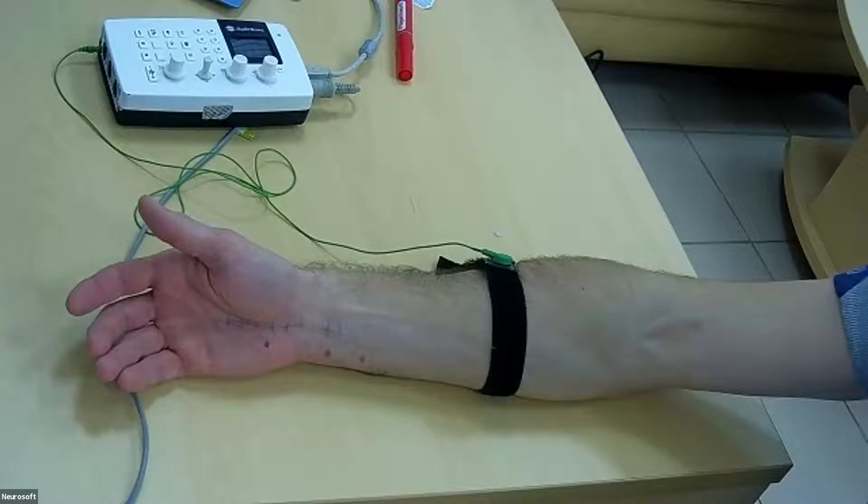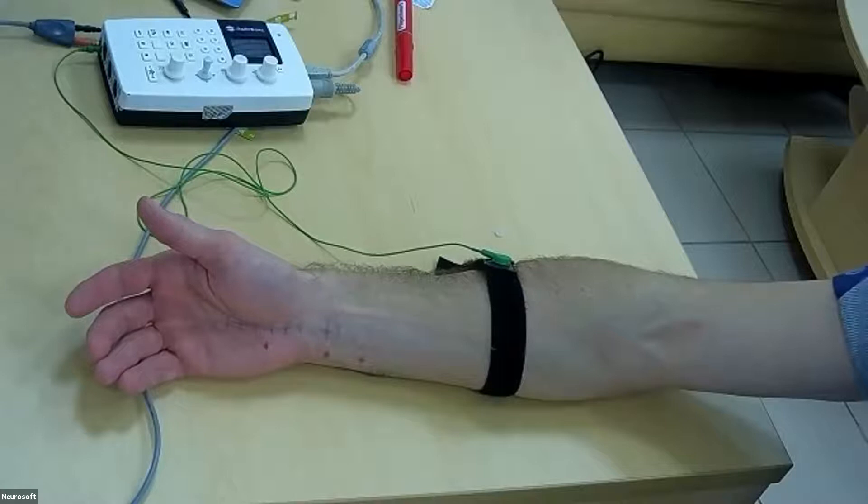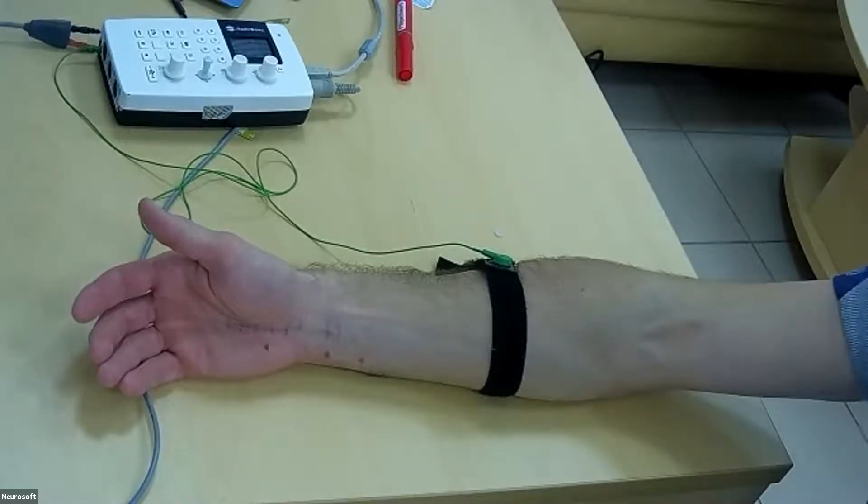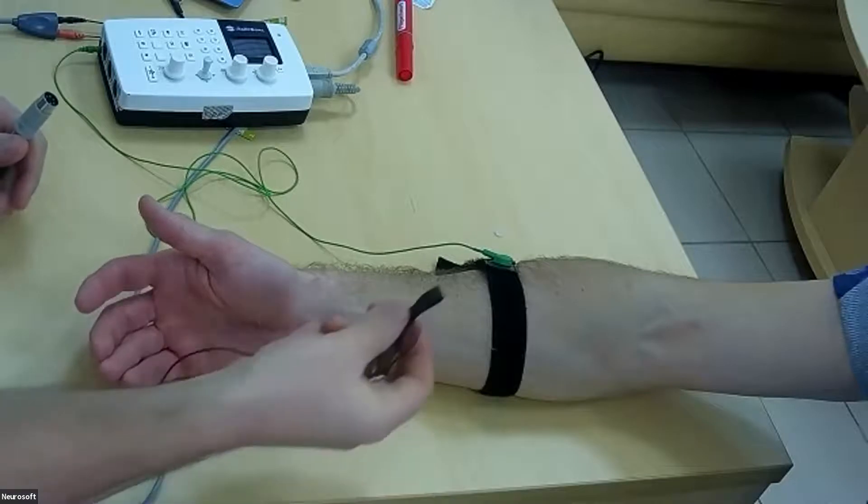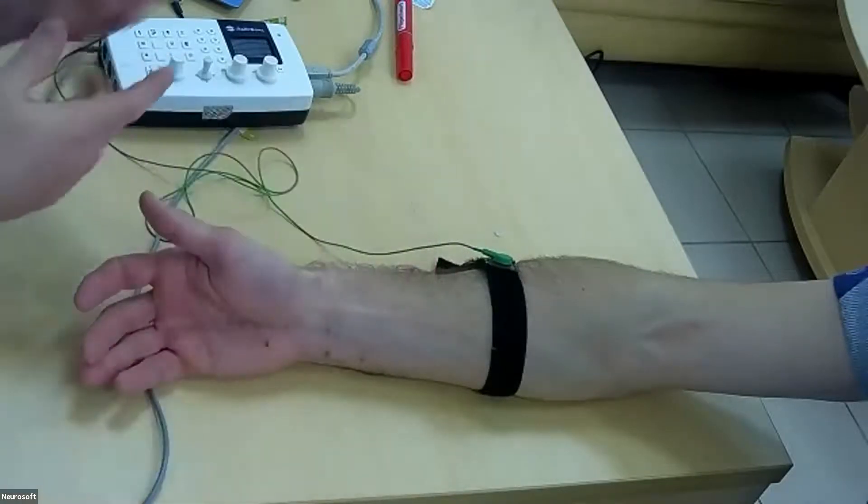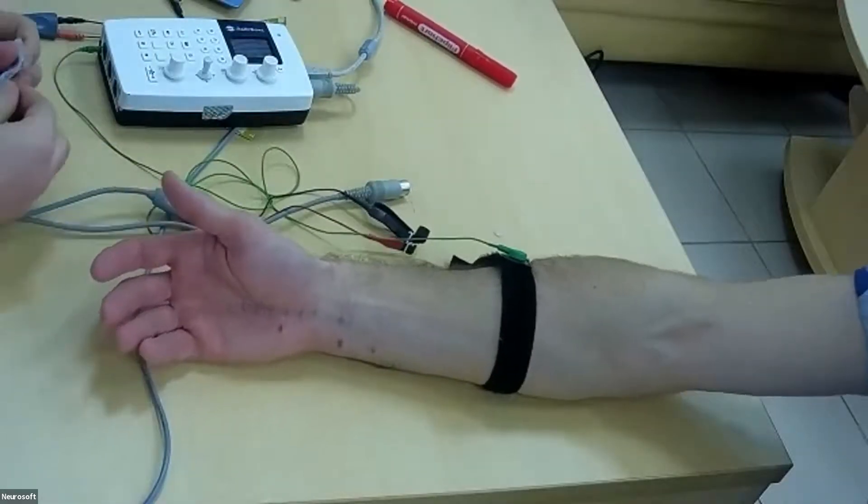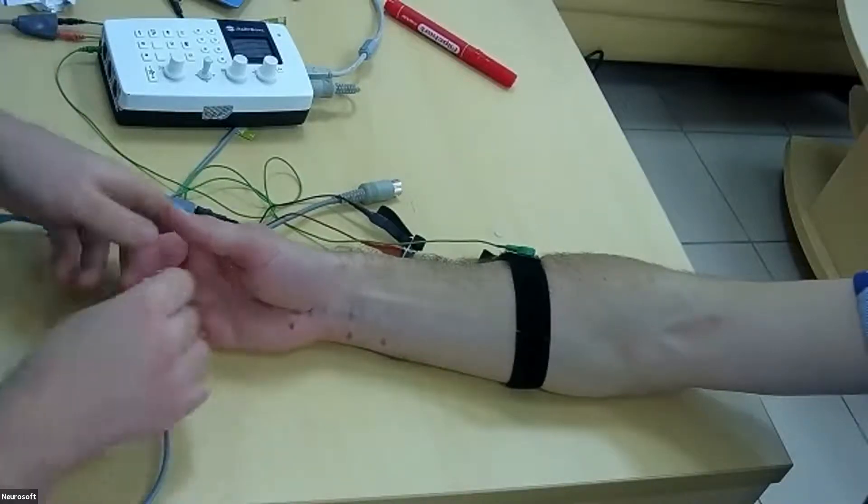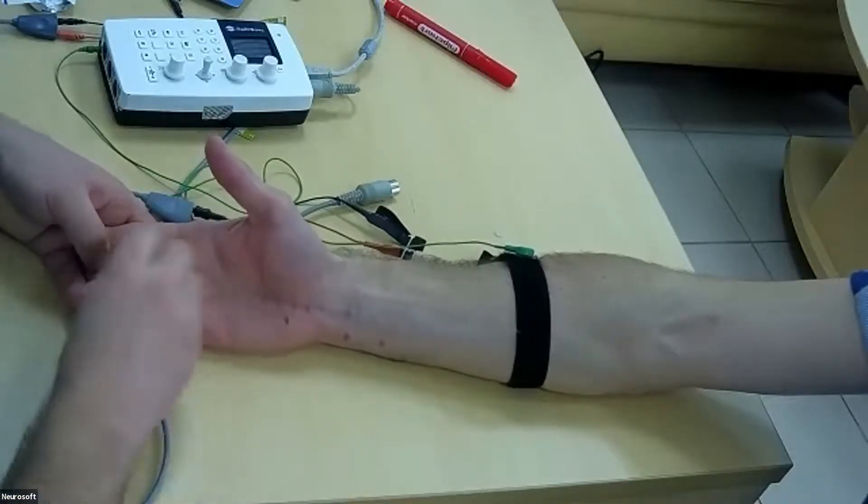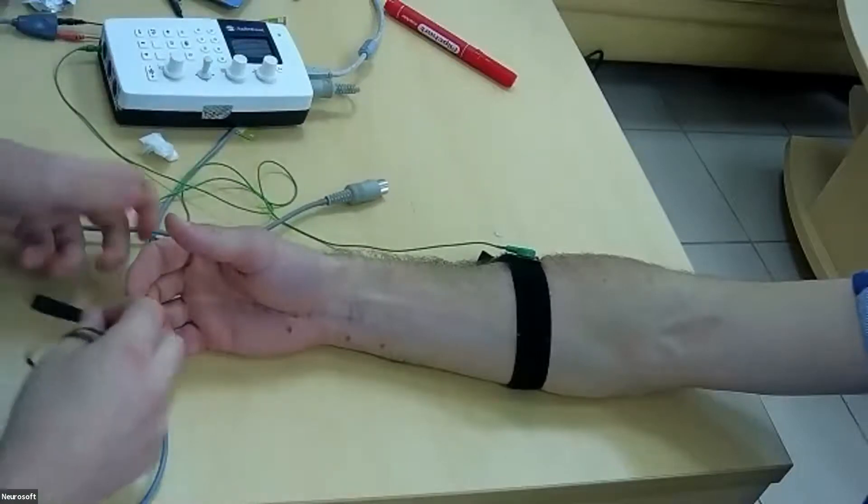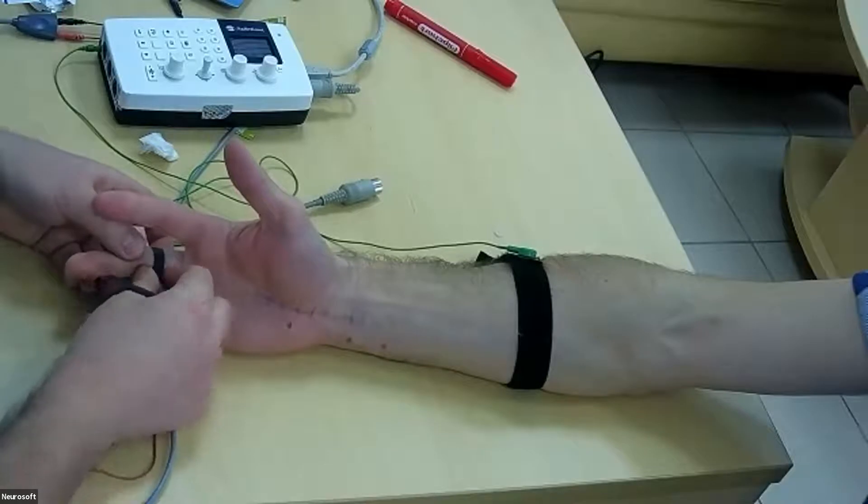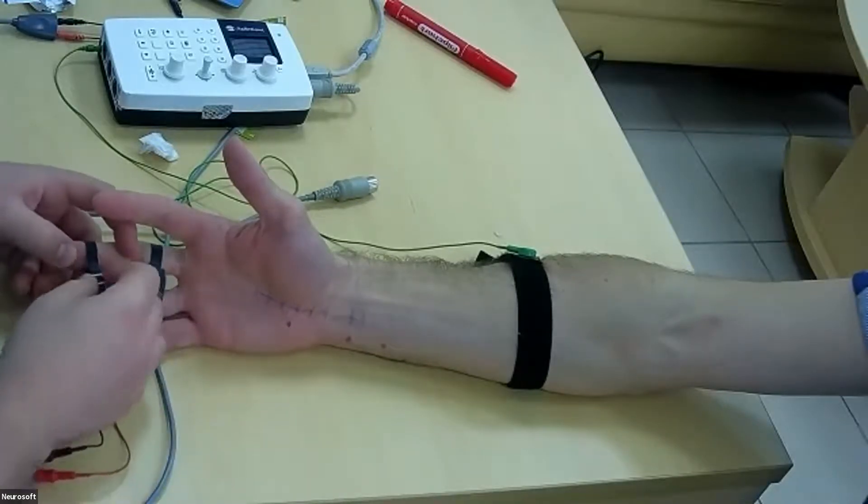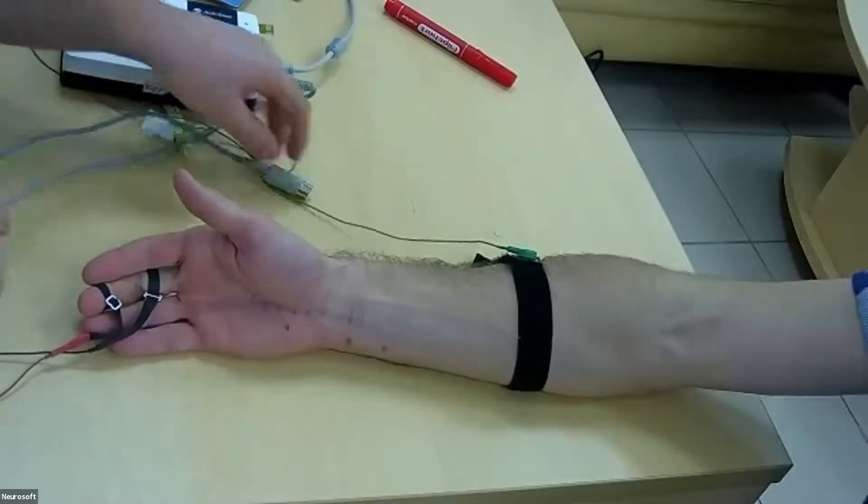First of all, we will start with sensory inching method. For this, we will use green electrodes. We should prepare skin with alcohol, scrub the skin a little. We set active electrode more proximal and reference more distally as for any sensory neuronal study.